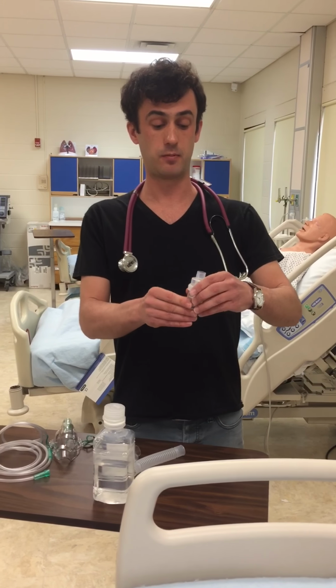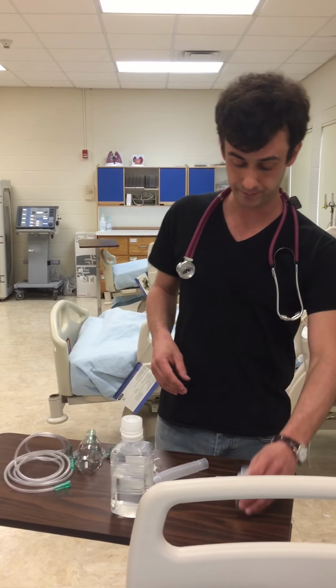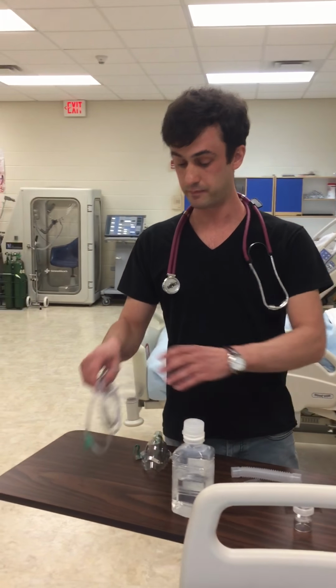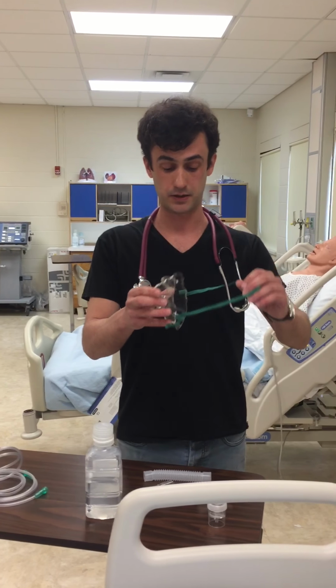I have a small volume nebulizer with 2.5 milligrams of albuterol in a 3 milliliter solution of normal saline. I have a corrugated tube, a T-tube, and a mouthpiece, oxygen tubing, and the normal saline. And for this procedure, I'm going to use an aerosol mask.